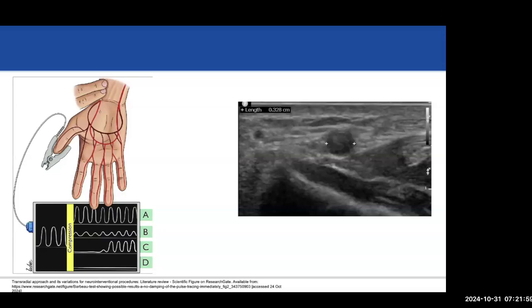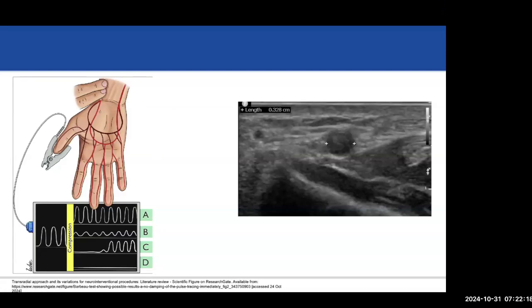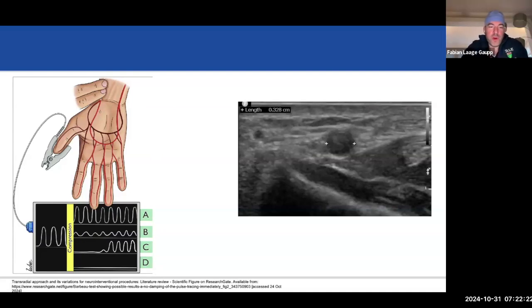Okay. Good. So you already mentioned that the radial artery can be quite small. So there's some workup that we typically do before we do radial access, right? There are two things. Have you heard of this test that's depicted on the left? Yes, the Barbeau test, which is also known as the modified Allen's test. Mm-hmm. And what's the point of that, or how do you do that?